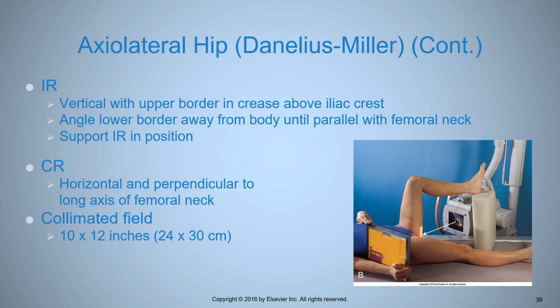But if your facility is serious about being a radiography department, it should have a positioning sponge that you can rest their foot and heel on. Do not rest their foot and heel on the X-ray tube. That's a big no-no. There's high voltage cables coming out of that thing. Don't do that.